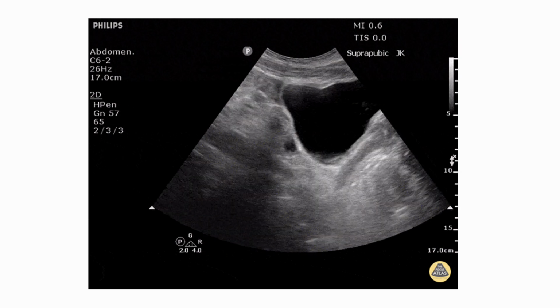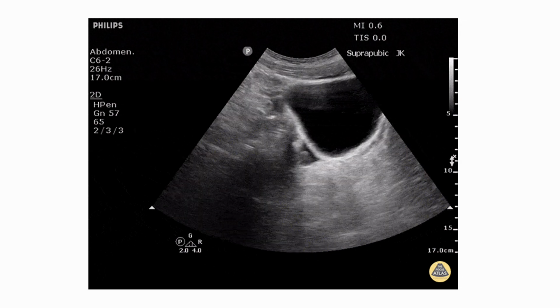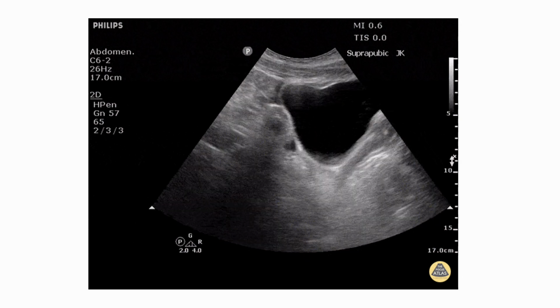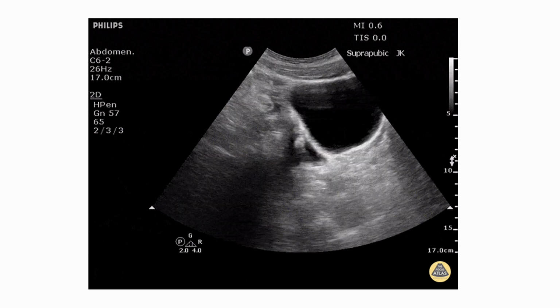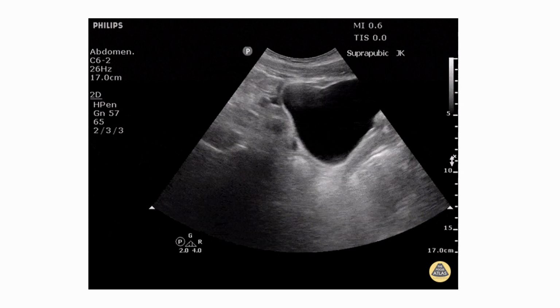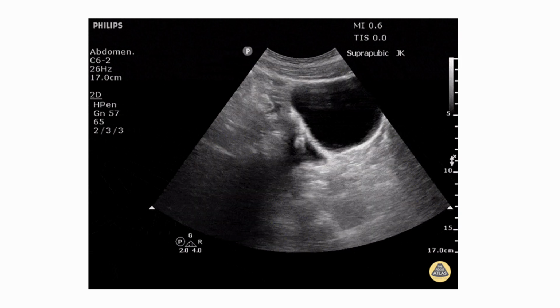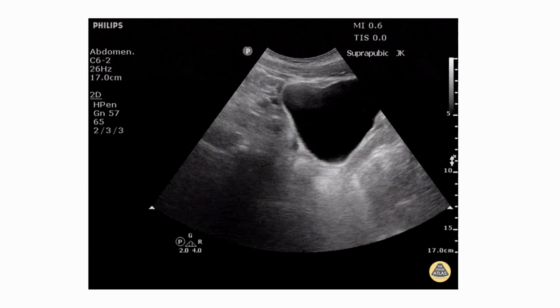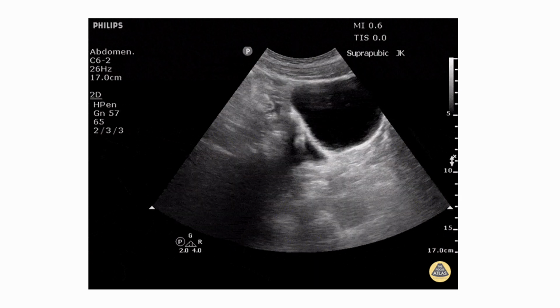So here we see an abnormal finding. We have the large fluid-filled bladder, but then to the left or superior of that, we're also seeing fluid-filled structures between that and the bowel. So the bowel is kind of obstructed, hard to see because it's filled with gas and air obstructs the ultrasound view. But between those structures, we see some black collections of fluid. So again, in the setting of trauma, that would be concerning for intraperitoneal fluid.